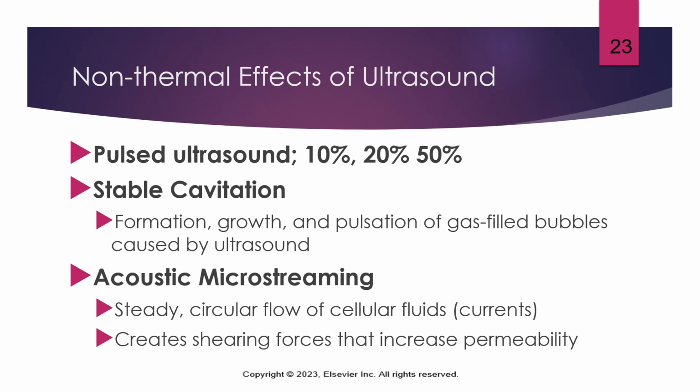This mode is going to typically help us focus on cellular tissue changes rather than just raising the temperature of the tissue. Now when we look at stable cavitation, this causes the formation and vibration of gas-filled bubbles in the tissues, which leads to different pressure surrounding those tissues, and it helps to enhance cellular activity and improve the exchange of nutrients and waste in the tissues.